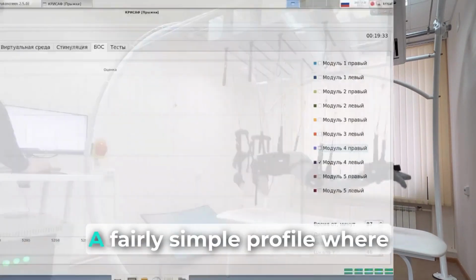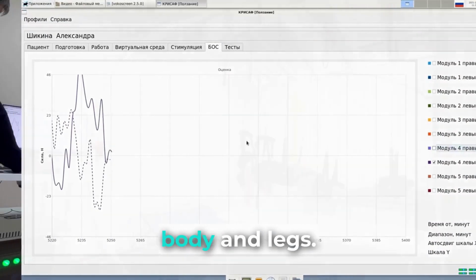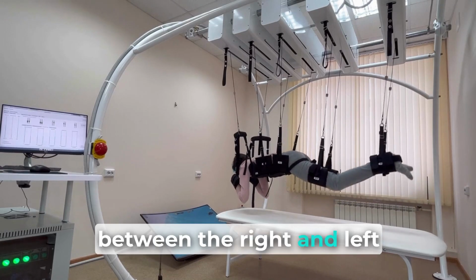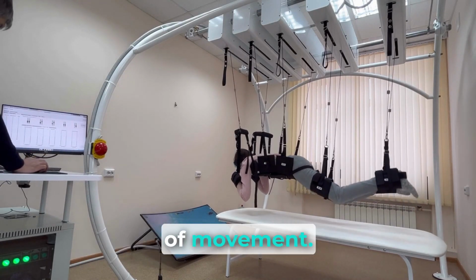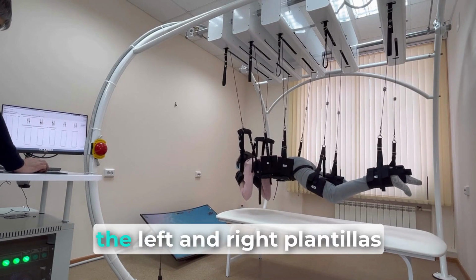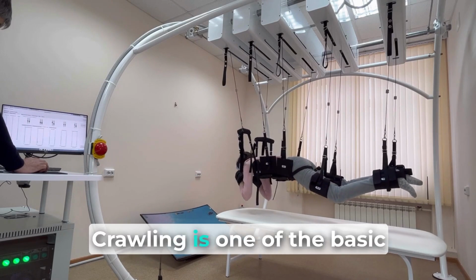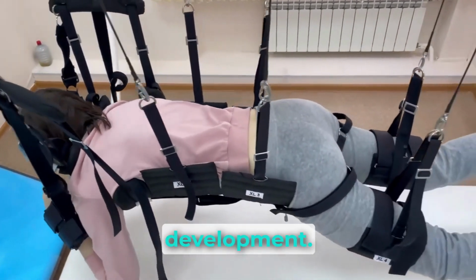Next, the crawl profile. A fairly simple profile where you can restore the interaction of the muscles of the body and legs, and restore the interaction between the right and left halves of the body. That is, work on the reciprocity of movement. In antiphase mode, called crawling mode, the left and right platforms move in opposite directions. Crawling is one of the basic locomotions that children master, one of the first during development.